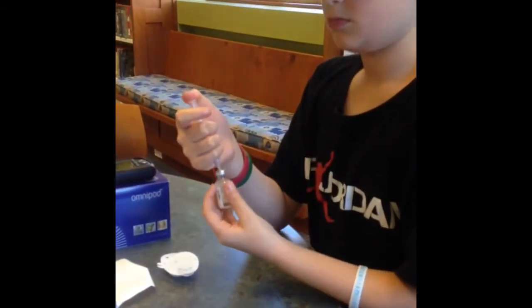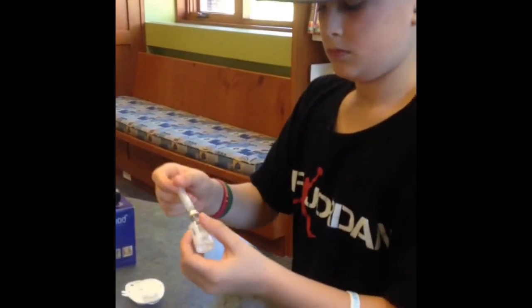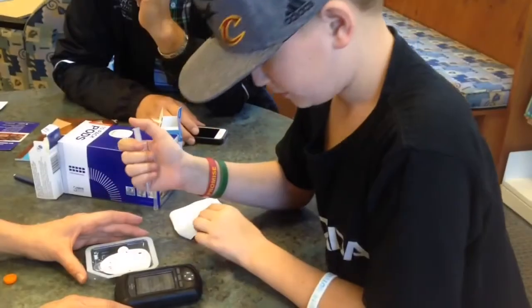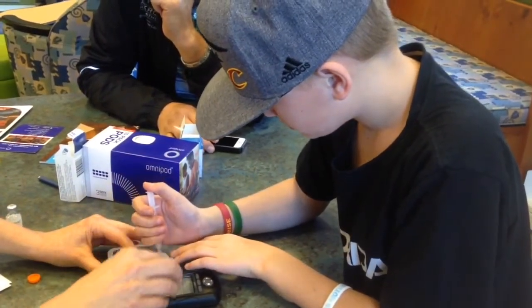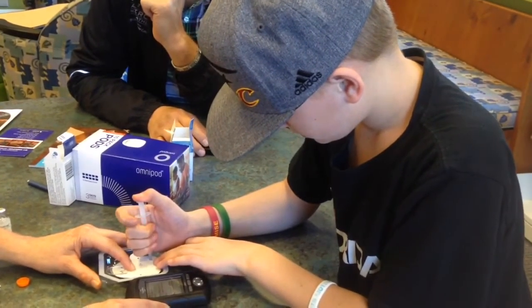There you go. Then you're gonna try to push the air in, and then you're gonna hold everything and turn it upside down. It's a little tricky, but you just gotta be careful you don't bend the needle. After filling, you fill the pod. So it goes straight in — you got it, kiddo. Good job. And they're touching into the right, and now you can push all the insulin in.